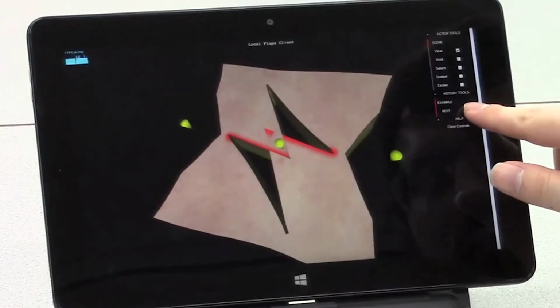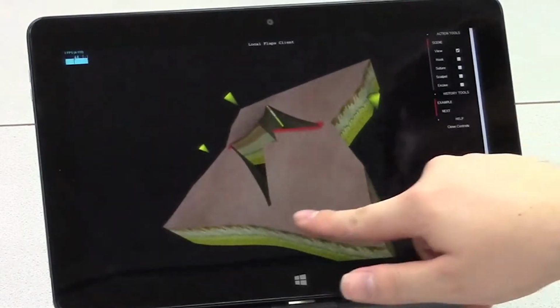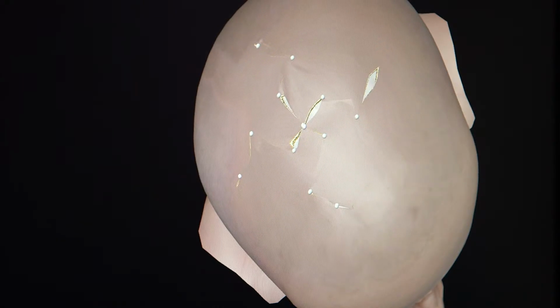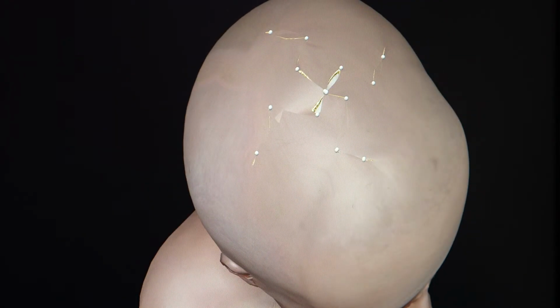So my vision is that this product is going to improve the quality of patient care by offering the clinical practitioners a better platform in which to exercise and hone their skill. So the long-term potential of this research is really bright. I think what we've got at the moment is an excellent foundation, and now we just have to build something incrementally, piece by piece, on top of that until we're at the place where we want.